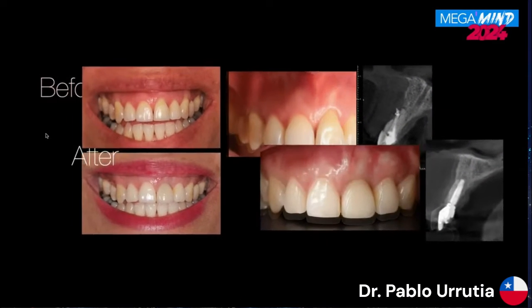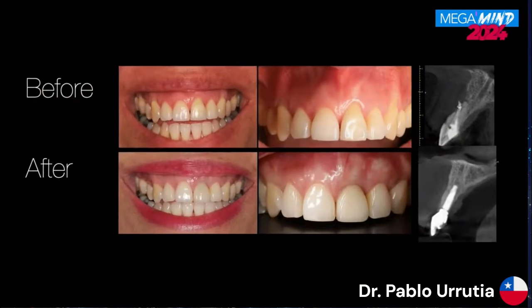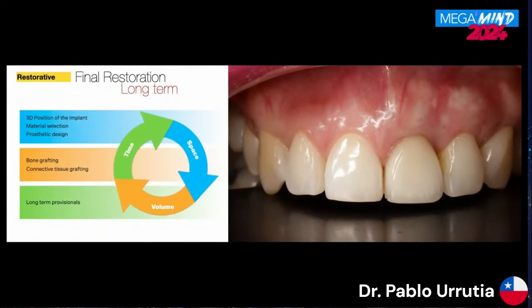And let's check the patient with the high smile, how they look. As you can see, this is an entire restoration of the upper jaw with gingival recession treatment, with coronally advanced flap, with the immediate restoration of the gingival margin with immediate provisionalization. And let's check how the patient goes.